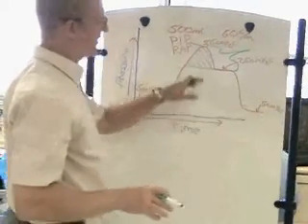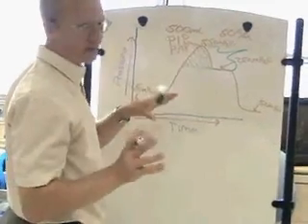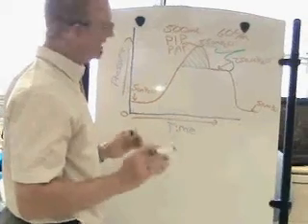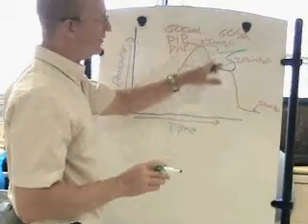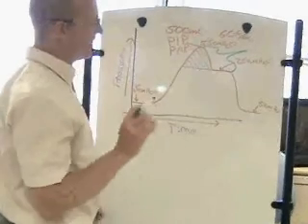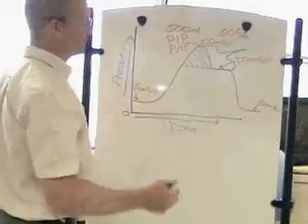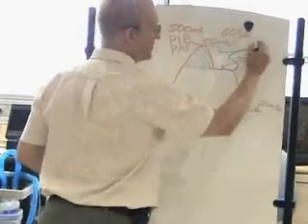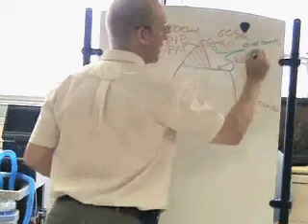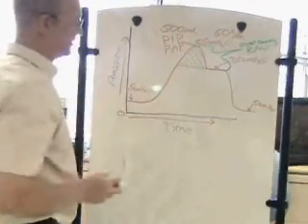Now, students get confused very often because I'll say, this is the pressure used to overcome airway resistance, and they'll start saying, well, 55 minus 25 is going to be your airway resistance. And I say, no. 55 minus 25 was how much pressure was required to push past all the airway resistance. It demonstrates the pressure needed to overcome the airway resistance. So when I write this in, you'll see that I'll write this overcomes airway resistance, or resistance in the airway. Okay, it's the pressure used to overcome the resistance in the airway.